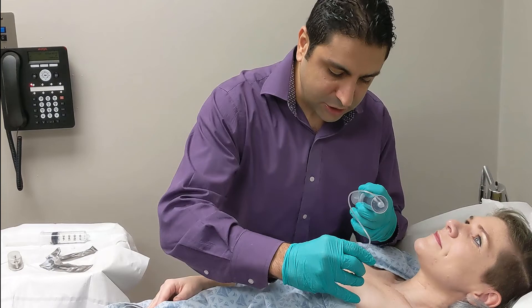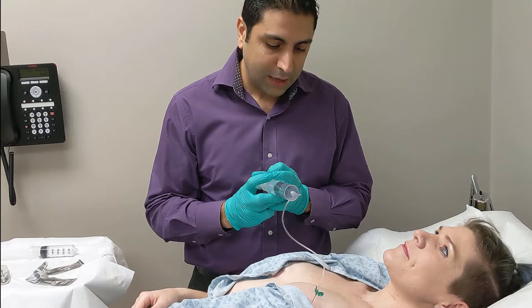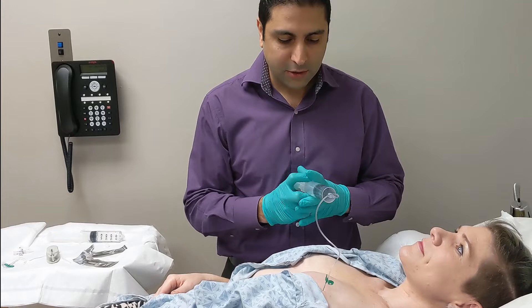You'll feel a little pinch — just a little pinch right there. It goes in and I immediately feel the port. Now I'm going to insert about 50 cc's of saline in there.